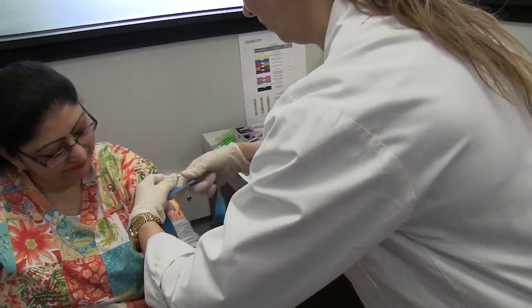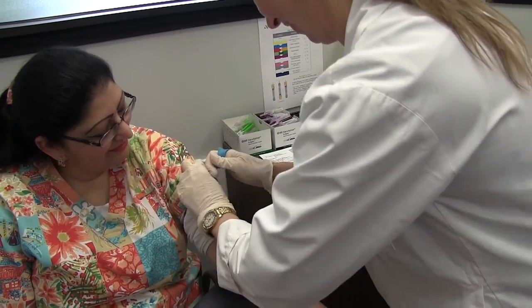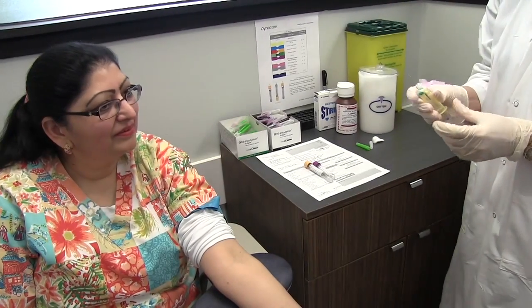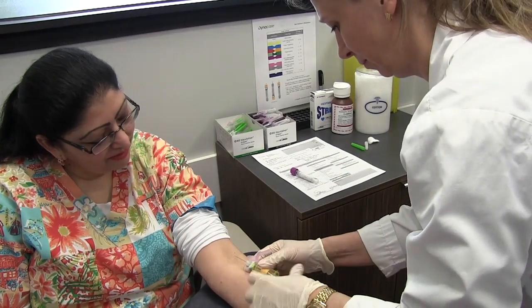Reapply the tourniquet and ask the patient to clench their fist without pumping their hand. Insert the needle swiftly, bevel up on a 30 degree angle or less in the same direction as the vein. Stabilize the holder while pushing in the tube and fill the tube with the required amount of blood following the order of draw.